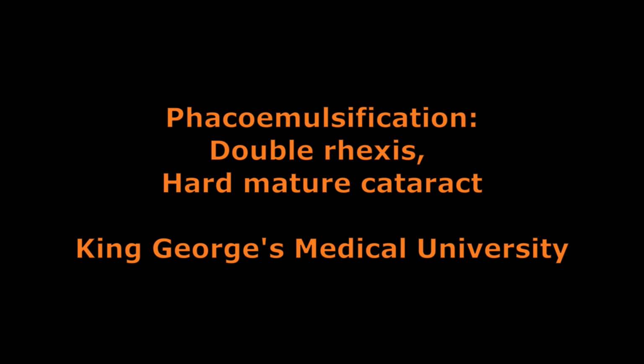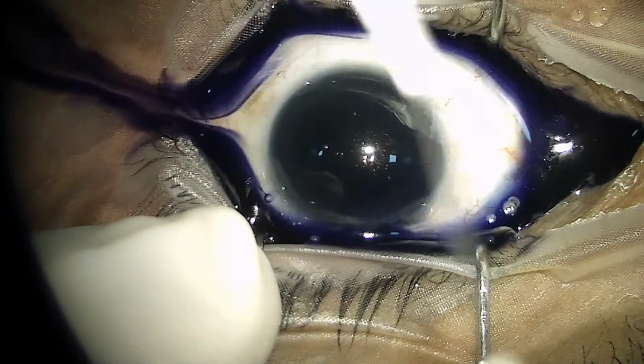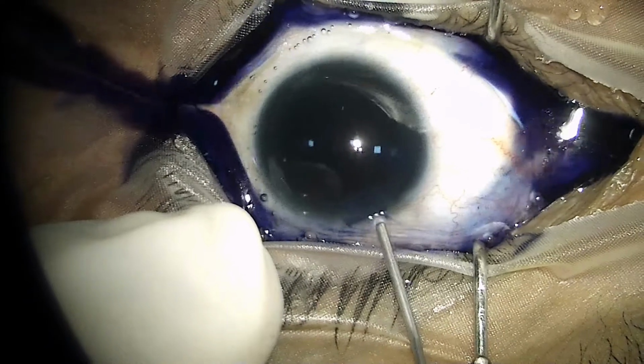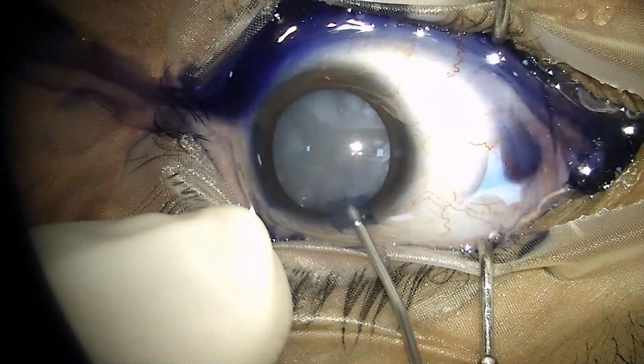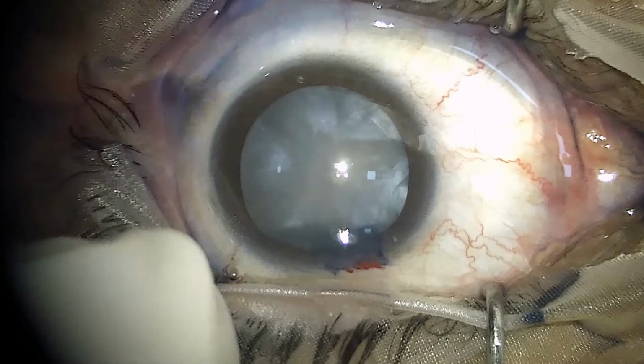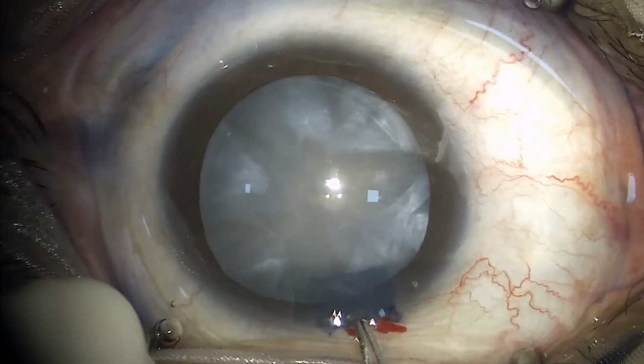Hello friends, this is one interesting video in which there was an intumescent cataract, a mature cataract, but with a very hard nucleus. In these situations it is advisable to prevent the ripping of the anterior capsule during the rhexis and producing an Argentina flag sign.